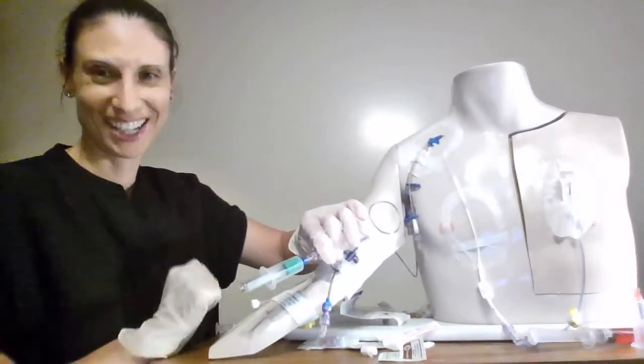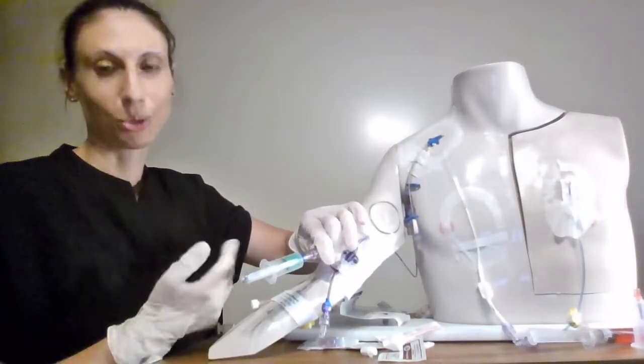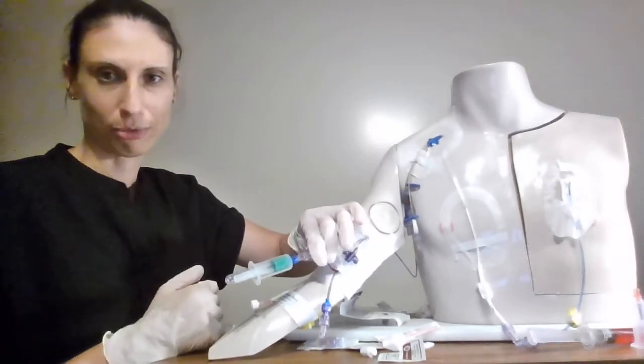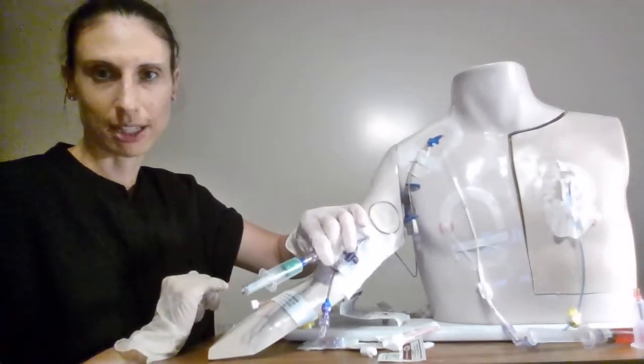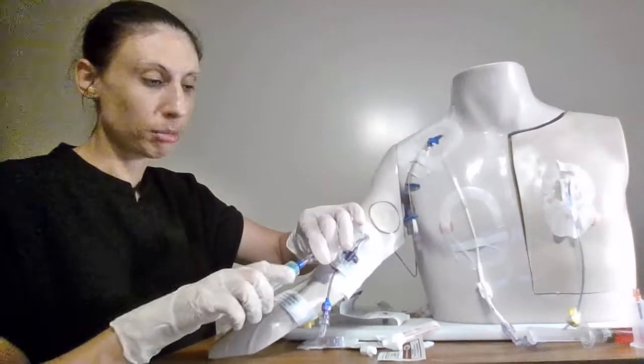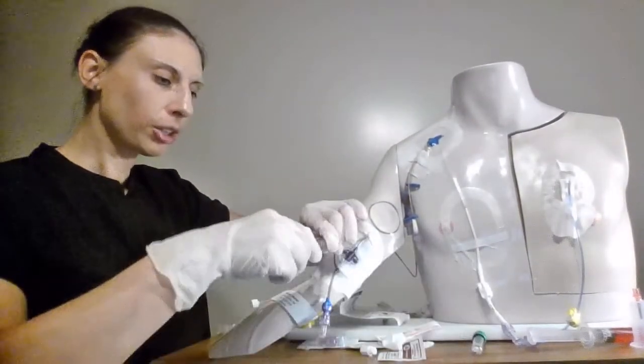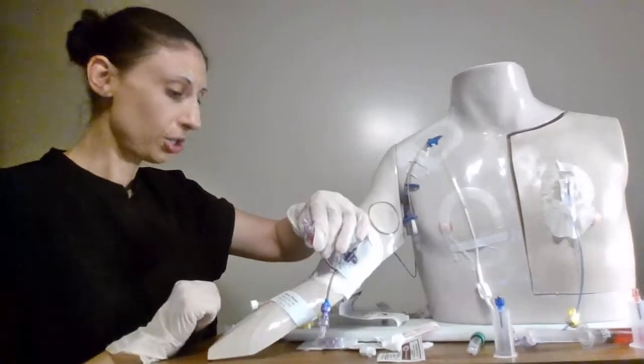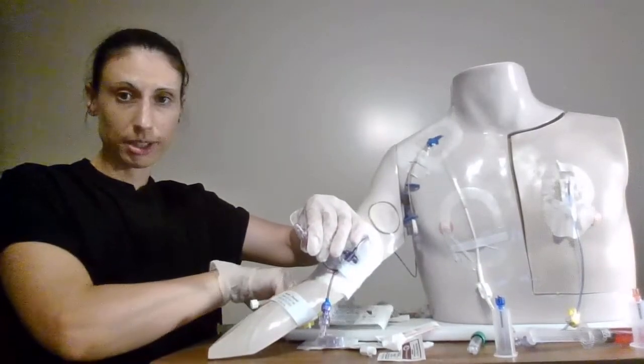My patient, this patient, has no blood pressure. In a real patient it should fill up for you because there's a pressure inside these tubes that will pull. Vacutainers though like I was saying for PICs can be a little bit finicky. So if that's not going to work or if you just prefer to use a syringe method that is completely fine too.